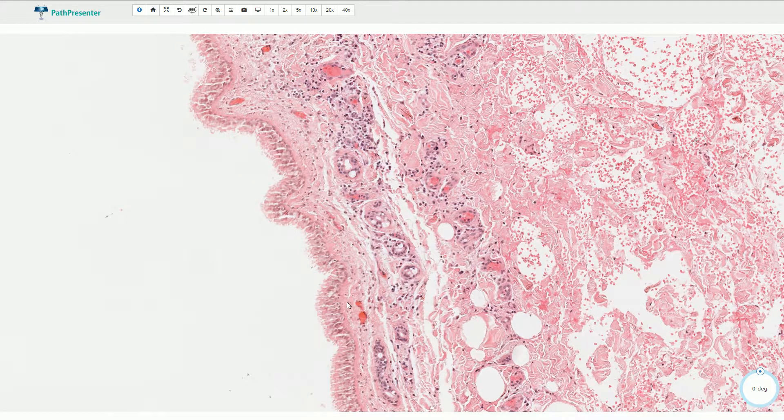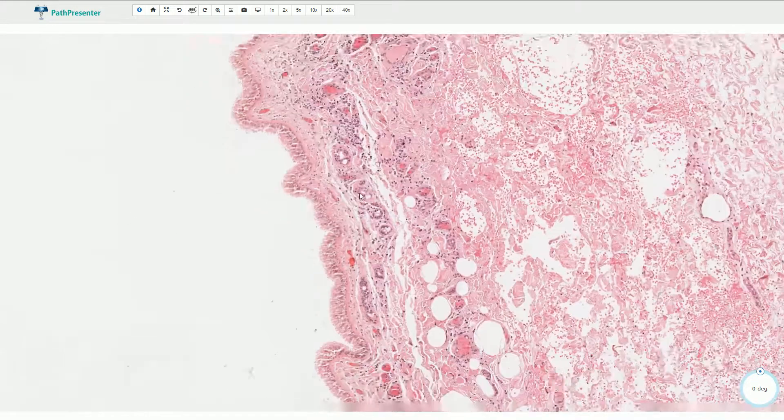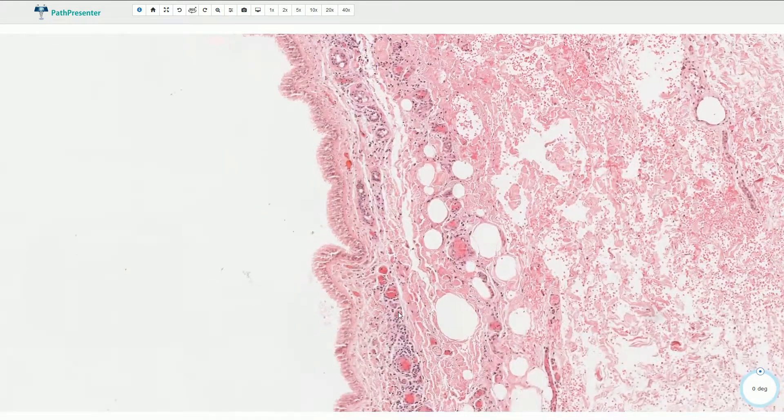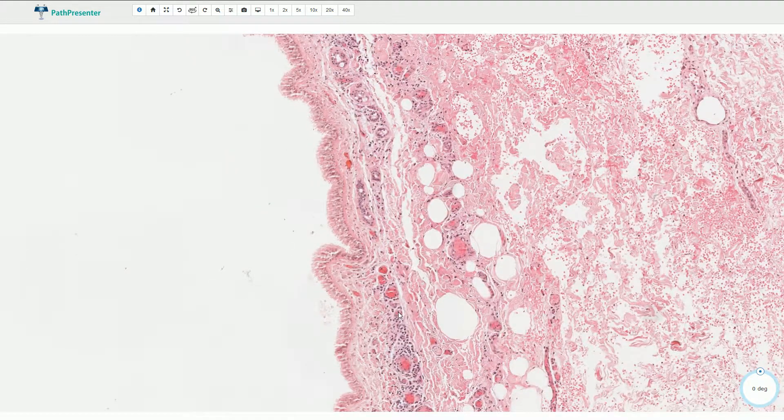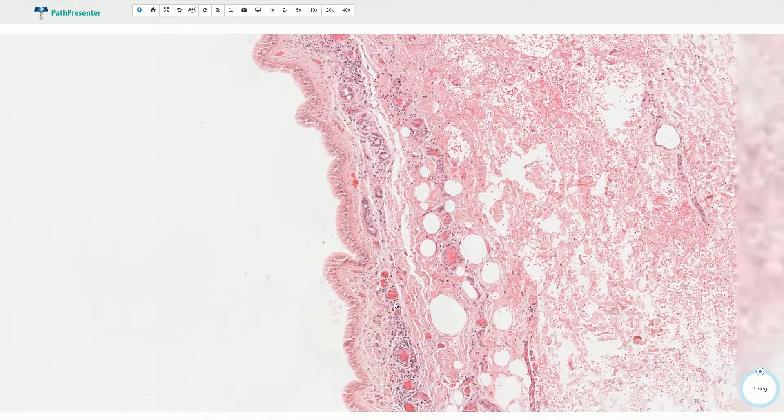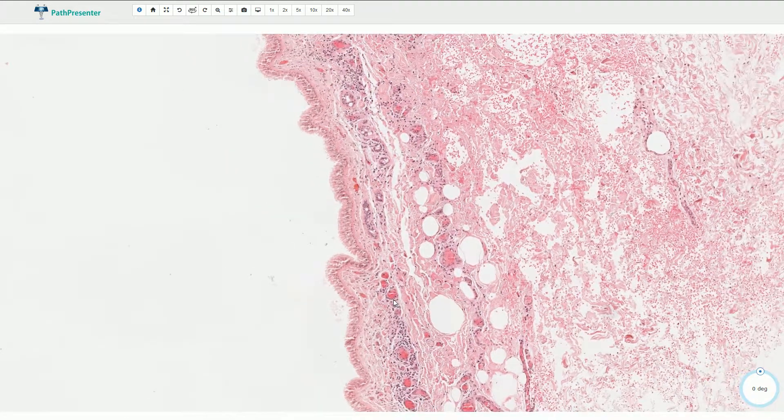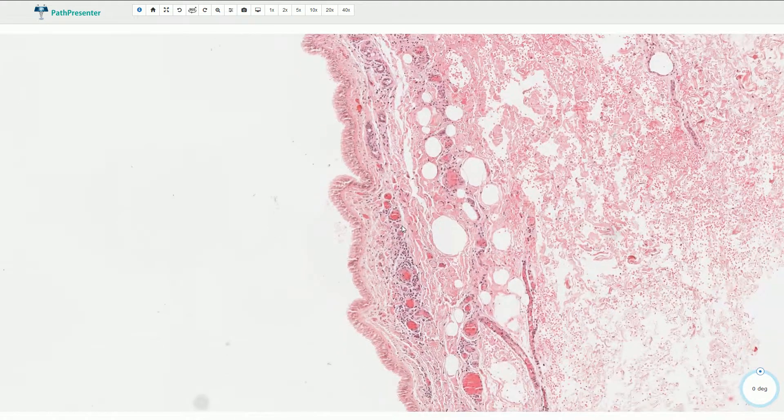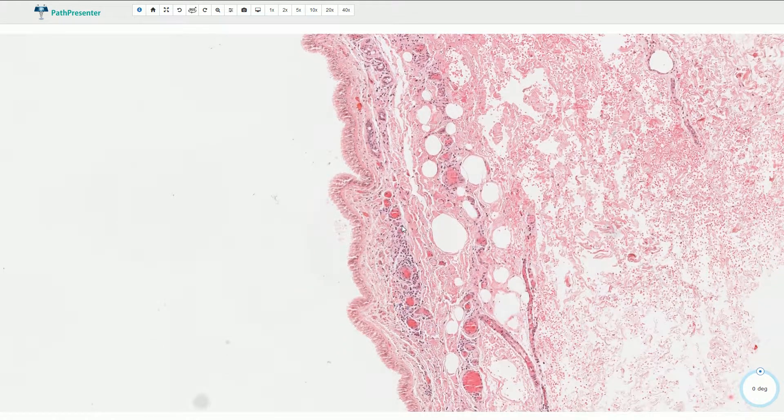So this is the typical appearance of the bronchogenic cyst and it is a congenital malformation. Thank you very much.